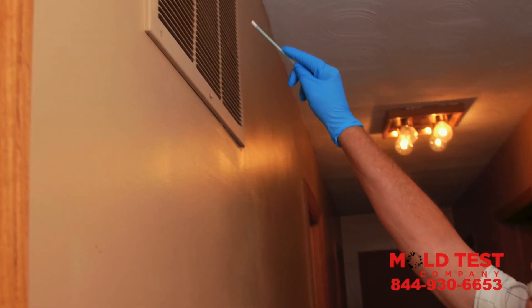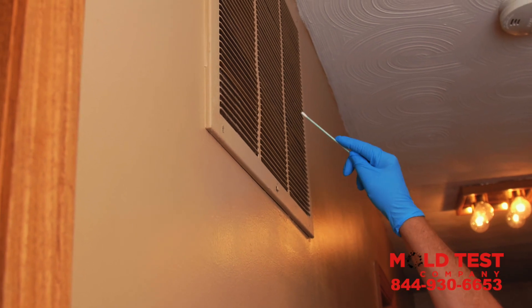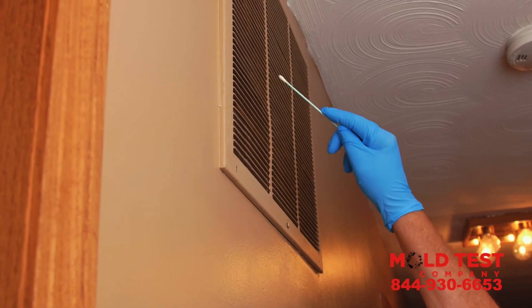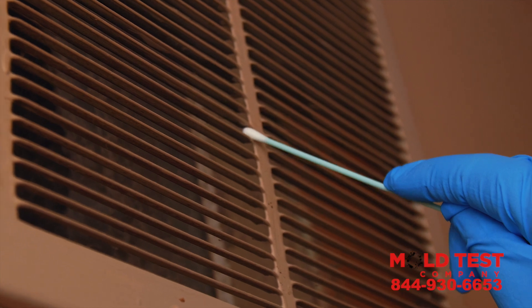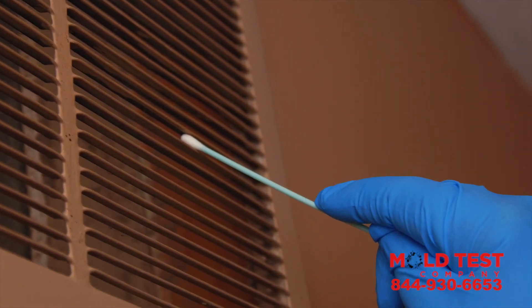Step 2. Wipe the swab on the HVAC return and HVAC registers throughout your home. Keep in mind, mold can live in dirt and debris around HVAC vents. For your most accurate results, you might also consider swabbing your HVAC filter for mold.